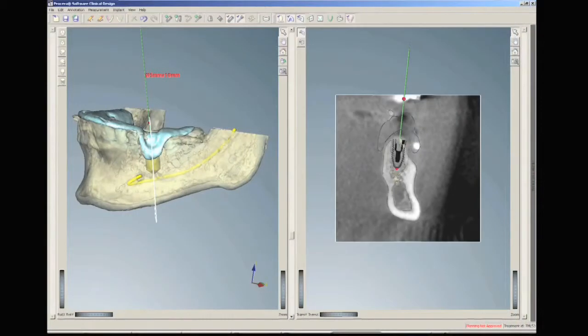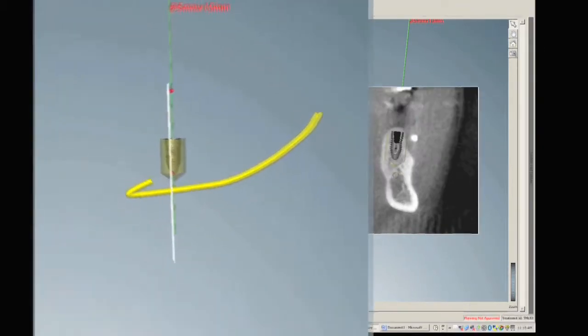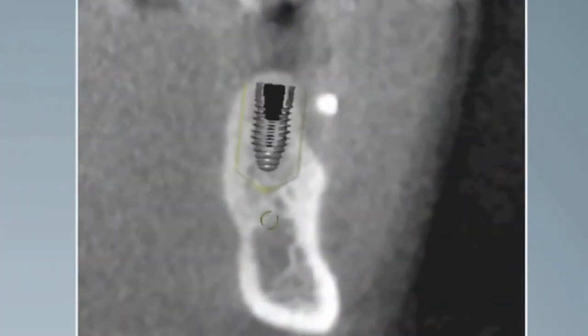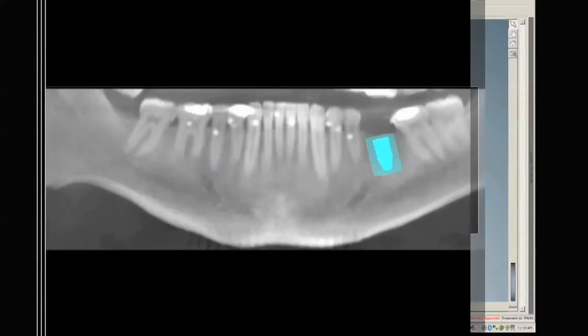One of the advantages of the three-dimensional image is that you can see the extent of the buccal defect. The planning software allows you to add and take away various images. On this screen, the bone and radiographic guide were removed, providing a clear visualization of the proximity of the mandibular canal and the implant. The yellow halo around the implant is 1.5 millimeters, which can be used as a measurement aid. In this case, we had good ridge height, allowing a large margin of safety from the canal.